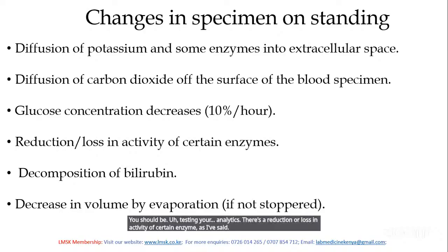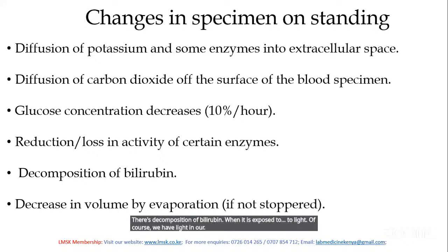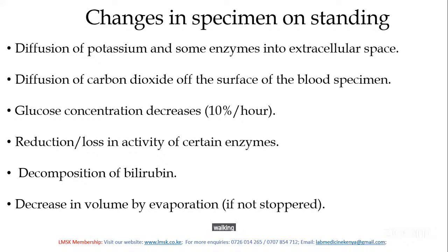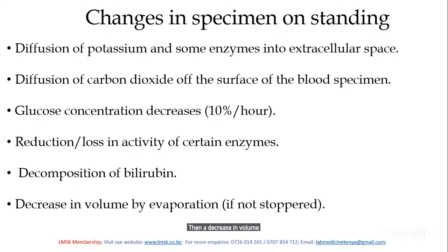There's decomposition of bilirubin when it is exposed to light. Of course, we have light in our working space. It is part of the working space. We need light. So it gets decomposed with time, so you should not let the specimen stand for quite a long time. Then a decrease in volume by evaporation.